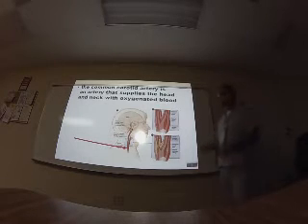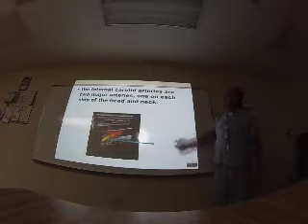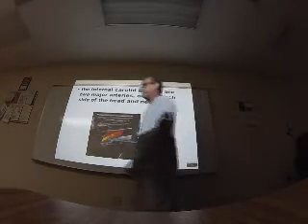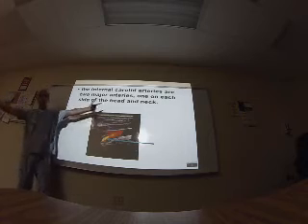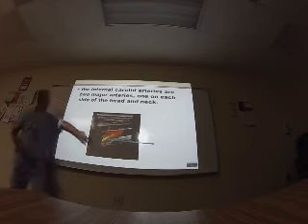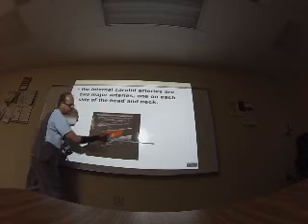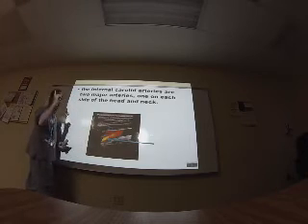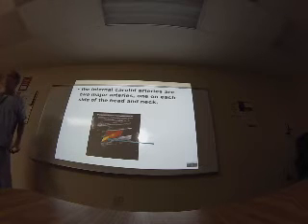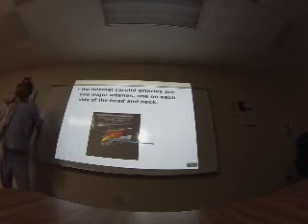This is very good. Remember, this is the common carotid artery. There are two major carotid arteries, one on each side of the neck. This is the bifurcation, with orientation in sagittal, anterior, posterior, superior, and inferior. This is the common carotid, and this is the bifurcation. In general, the big one is called the internal carotid artery. It goes to the brain. The little one is called the external carotid artery.